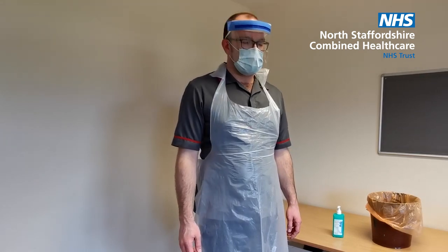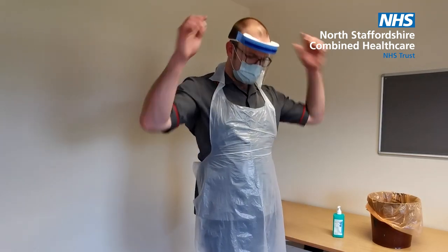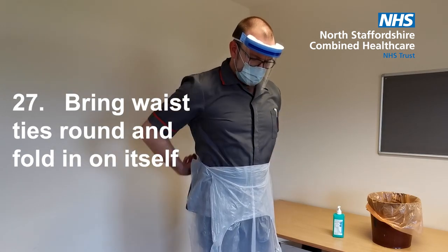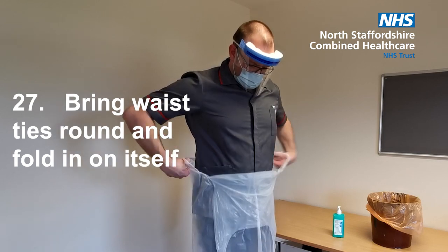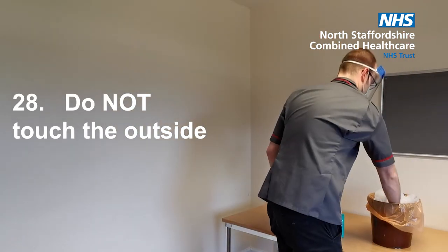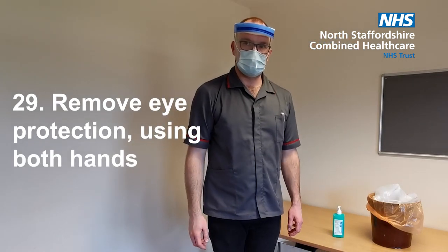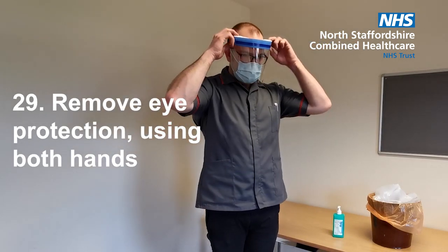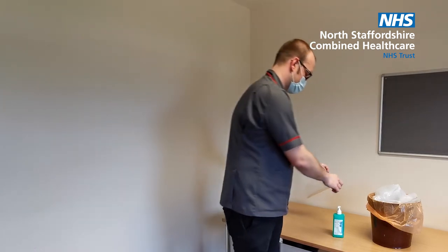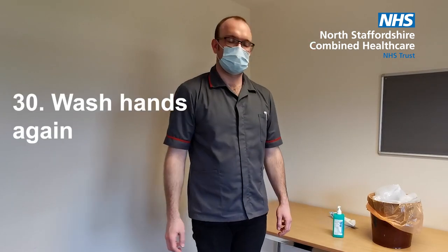To take off your apron, unfasten or break the apron ties at the neck and let the apron fold down on itself. Break the ties at the waist and fold the apron in on itself. Do not touch the outside — this will be contaminated. Remove the eye protection using both hands to handle the straps by pulling away from the face and discard. Wash your hands again.